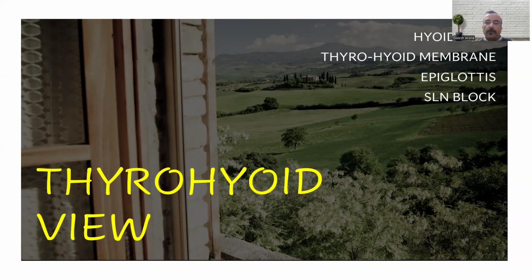In thyrohyoid view, we are trying to visualize the thyrohyoid membrane, the epiglottis, and this view can be useful in performing the airway blocks, particularly the superior laryngeal block.